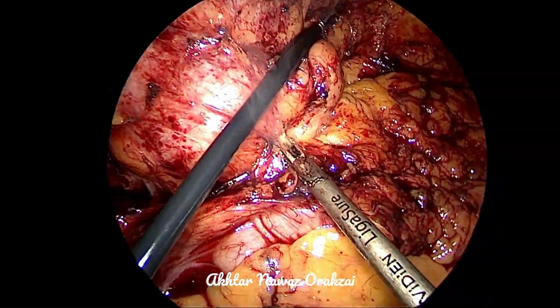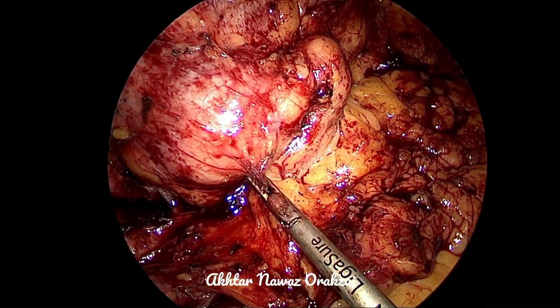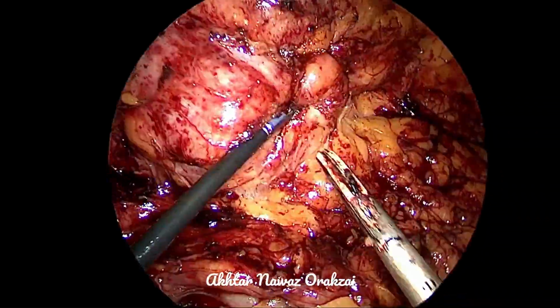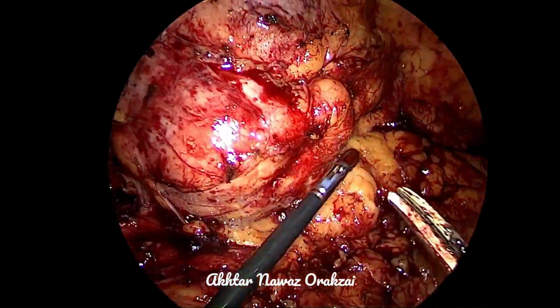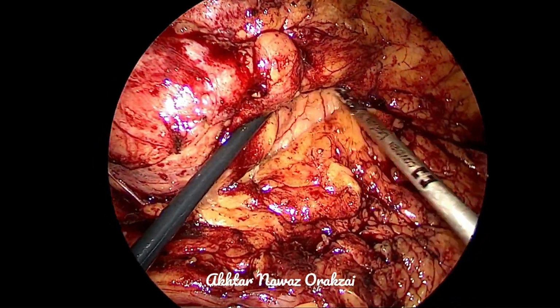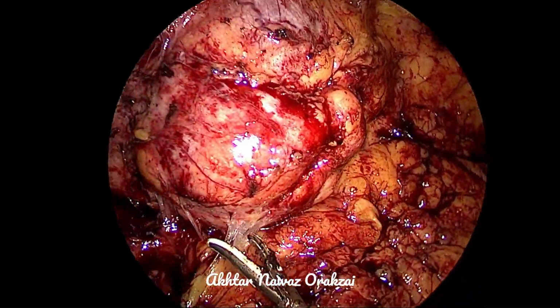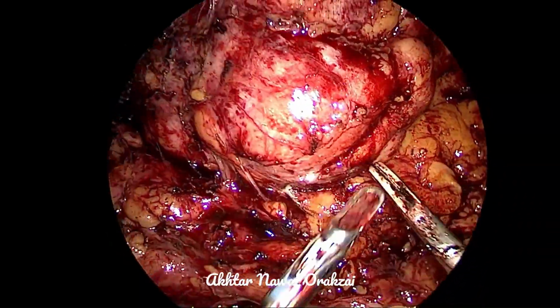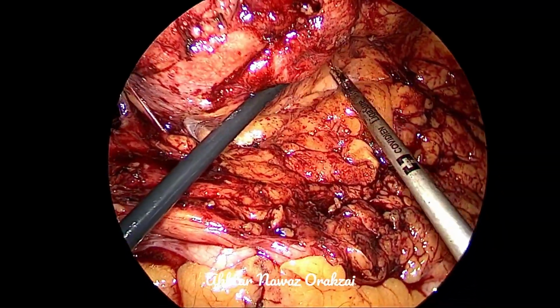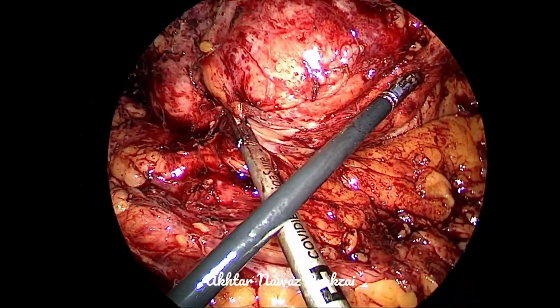Once we have mobilized the colon enough, then we go up again and see if we can continue with the dissection. However, the threshold here for conversion should be kept low, because it is always safe to open up the patient rather than to complicate the patient.